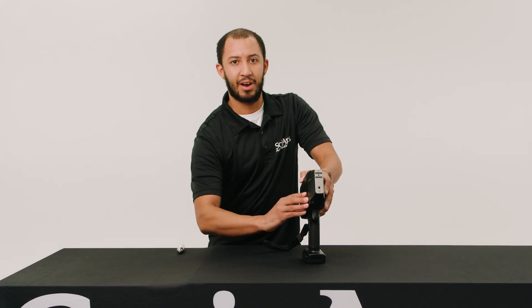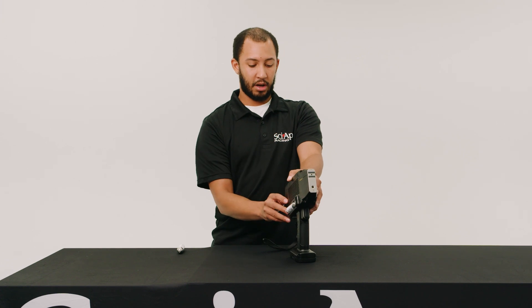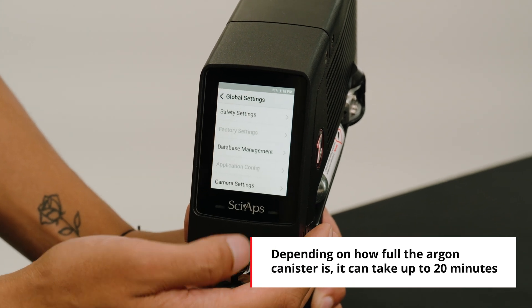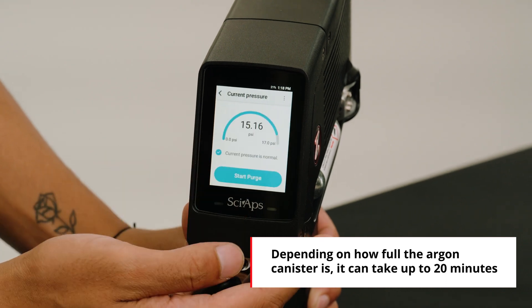If for whatever reason you're traveling or you need to remove or empty the argon tank, we do have a feature where you can purge the tank itself. Go to Settings, then Safety Settings, then Argon Purge, and from there you can start your purge.